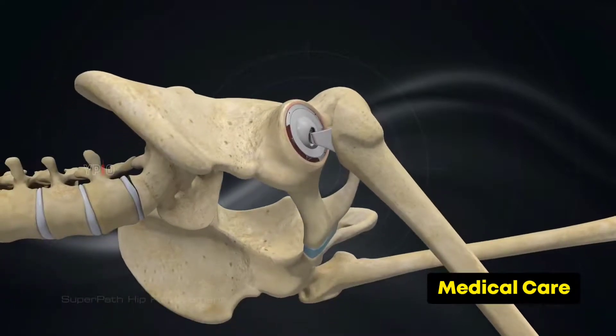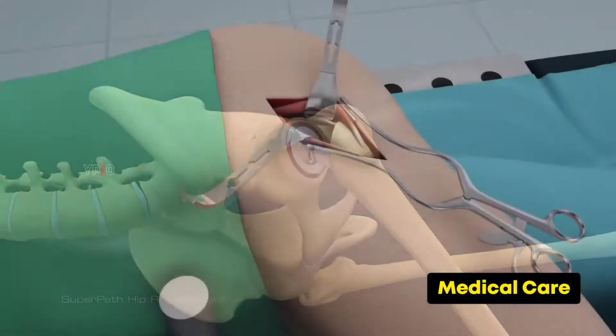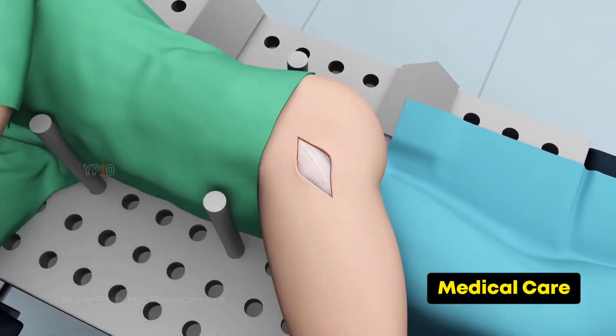Once the acetabular and femoral implants are secured, they are put together to form your new hip joint. The stability and movement of the joint is then tested. After replacing the hip joint, your surgeon performs soft tissue repairs and then closes the skin incision.